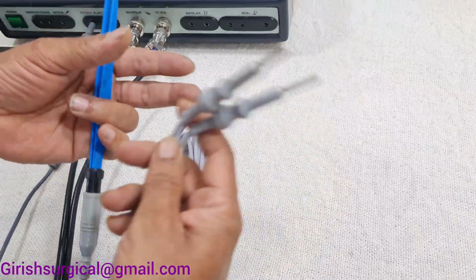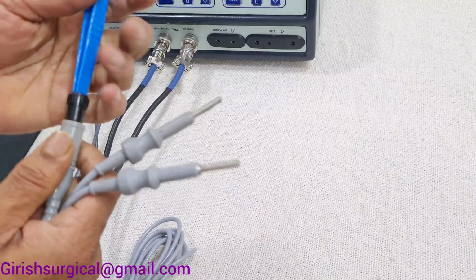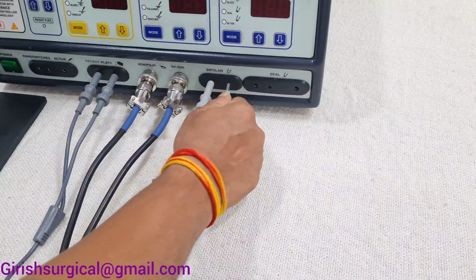This is the bipolar forceps with cable cord. As I told you, you have to dismantle this if you want to autoclave. And these two banana jack pins will be going to the machine end.